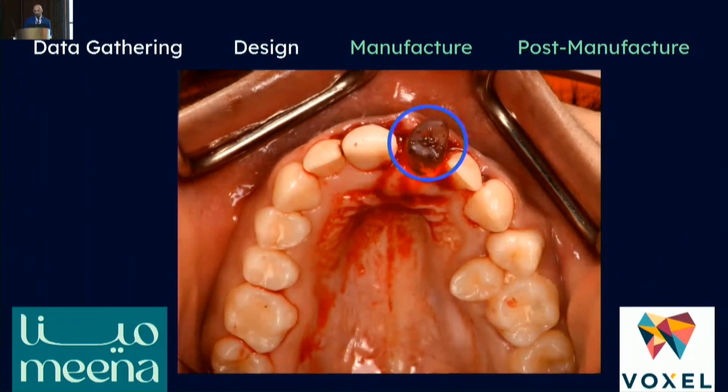the tooth replica was printed with surgical guide resin and was sterilized. This way, the auto-transplantation was practically achieved as seen in the blue circle, while the actual tooth stayed in its socket. This is done to minimize the possible damage to the PDL of the tooth and to be able to extract and immediately auto-transplant the actual tooth with no delay.